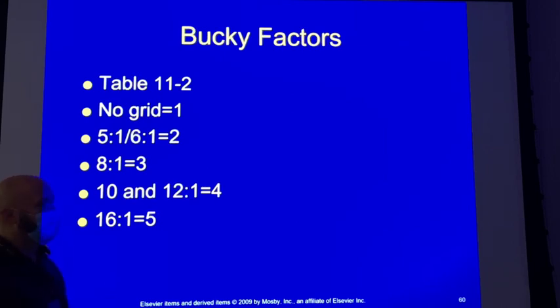They need to start the feeding on the patient. You're on the floor to do a KUB for feeding tube placement. They need to start it like right now. You don't have a grid. Is it worth going to the department to get a grid to shoot that KUB?